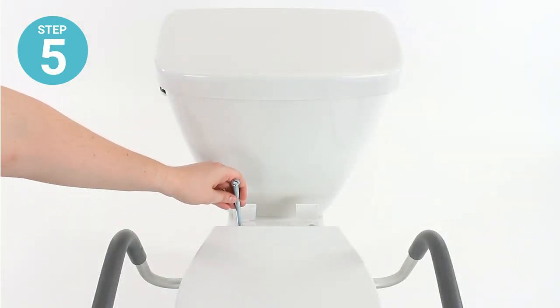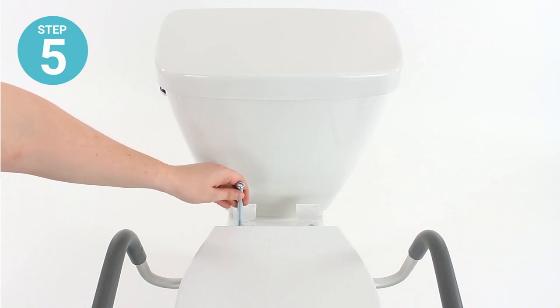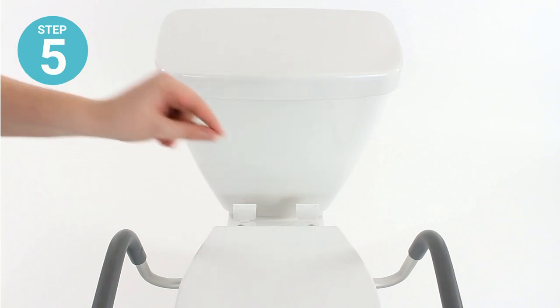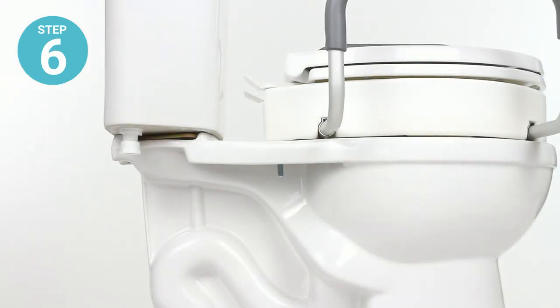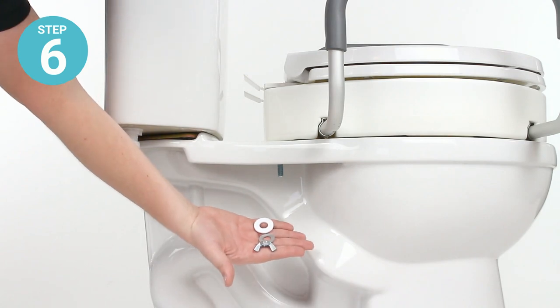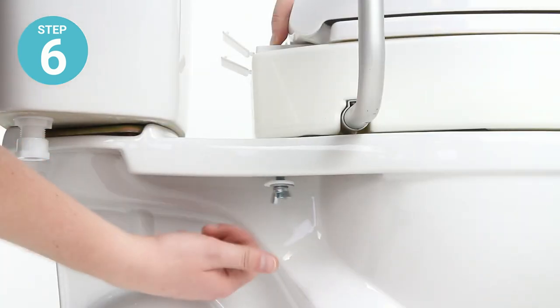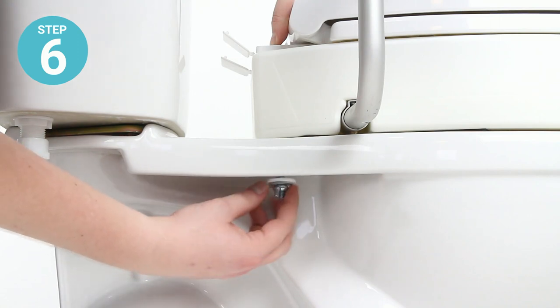Step five: fit one of the long bolts through the attachment point for the toilet seat, through the riser, and into the toilet itself. Then attach the other one in the other spot. Step six: secure the bolt with the included washers and wingnut. Fit the wingnut after the washers and tighten. If needed, a washer can be placed beneath the bolt head.